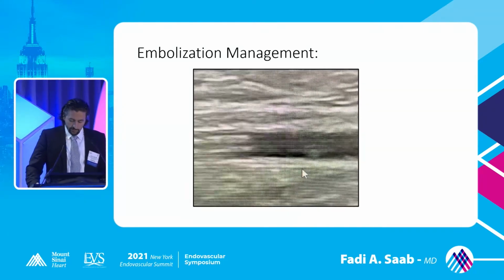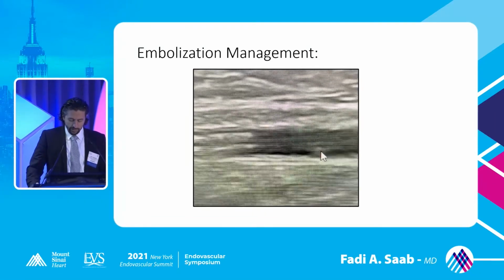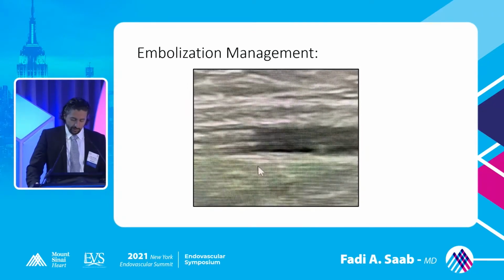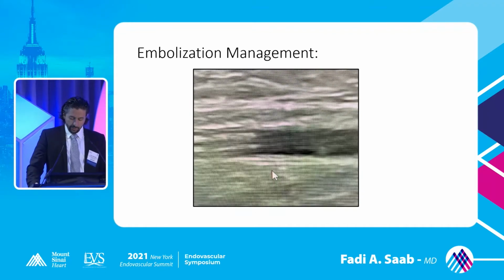Embolization. This is a debris. You can see the arrow. This is the tip of the catheter right there. This is the 5 French catheter, and this is the debris right there. And this is in real time. I'm slowing it under ultrasound, and we were able actually to capture that debris in real time.